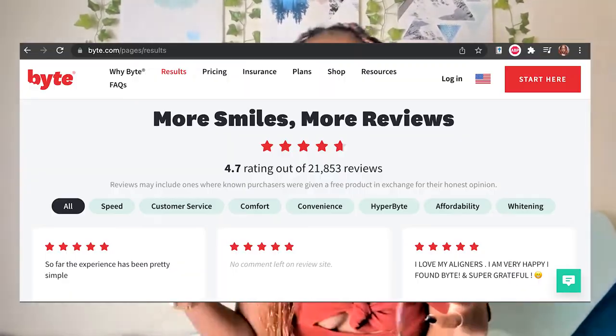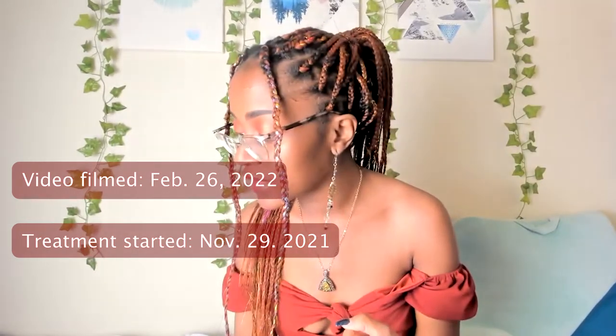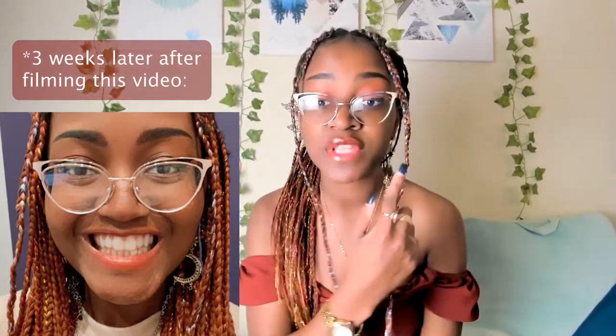I got my braces from a company called Byte. As I am filming this video it is February 26th, and I started my treatment on November 29th. That is basically exactly three months, and I still have about three weeks left of my treatment. Here's how my teeth look right now.